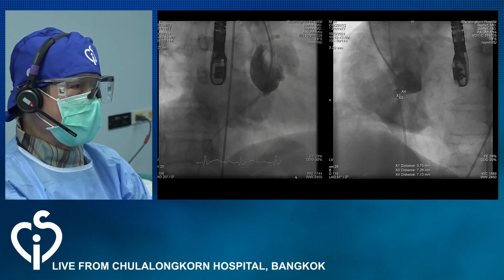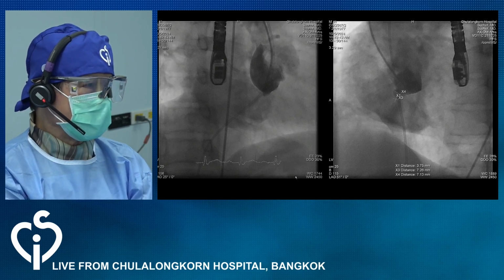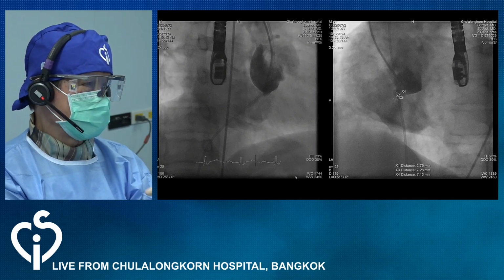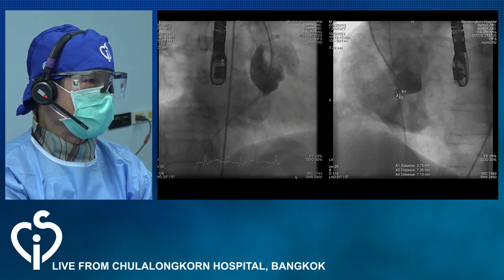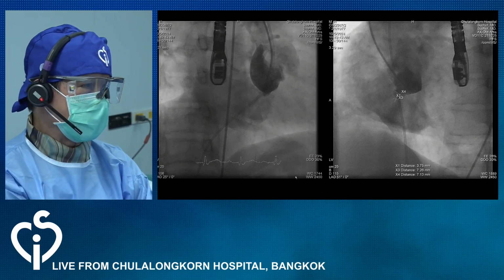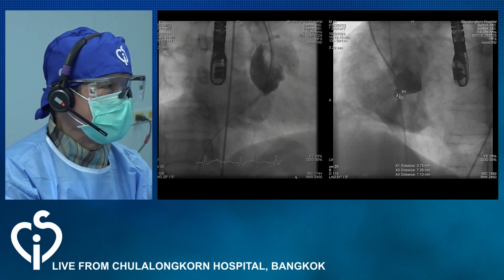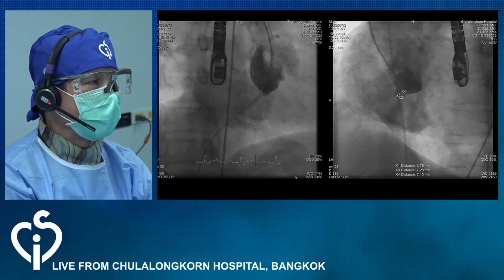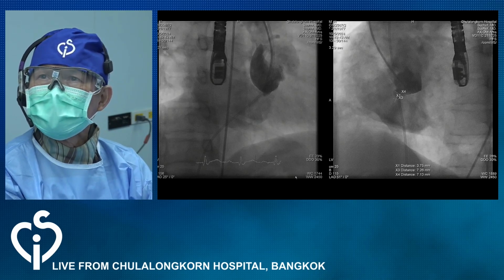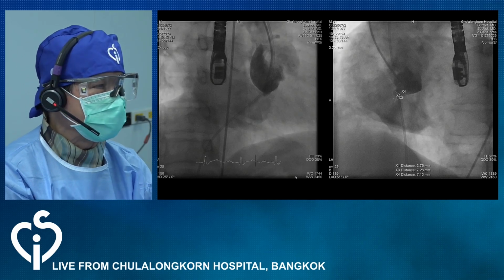But what I am not sure about is the tissue in the sac, whether it is soft or not. So as someone has already mentioned, I will use ADO1 and upsize the RV opening by 4.